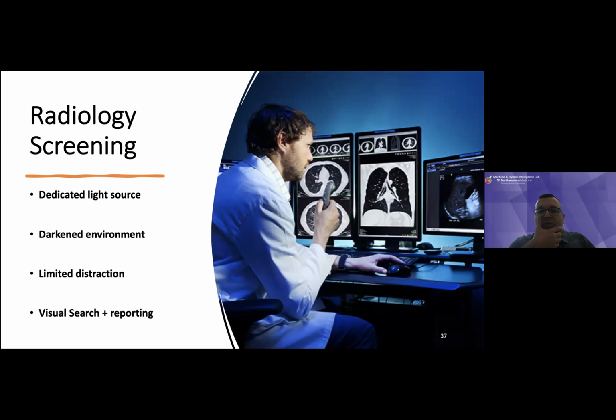So first of all, with a lot of computational and engineering effort, we want to have this seamlessly integrated into radiology rooms, where usually it is a darkened environment, and there is a dedicated light source and limited distraction. What the radiologist does is visual search for each scan for particular examples, and there is also reporting, and nowadays this is done by speech to text, the microphone and recognition systems. So we want to integrate this eye tracking system into this environment seamlessly.